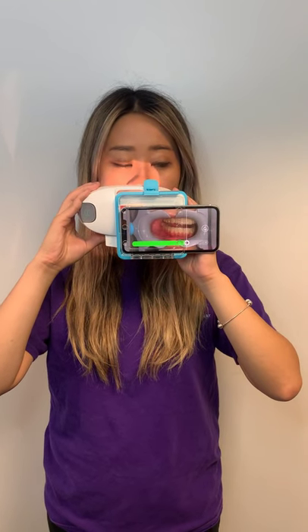Finally, the app will direct you to look back to the center to finish the scan. You are to do this three times: one with your teeth together, one with your teeth slightly apart as if your tongue was to fit through, and one with your teeth slightly apart while wearing your aligners.